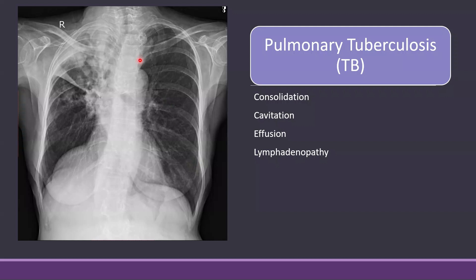An important feature of this consolidation is that the trachea is shifted toward the same side, and similarly the horizontal fissure — which is normally horizontal at the level of the hilum — is pulled up. This means that this is a chronic process. So we need to think about chronic causes of consolidation like tuberculosis, fungal infection, and other chronic infections.